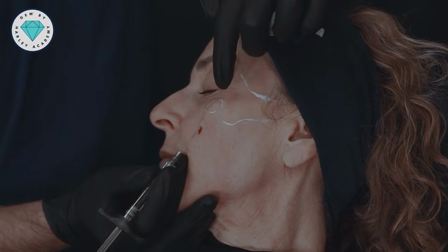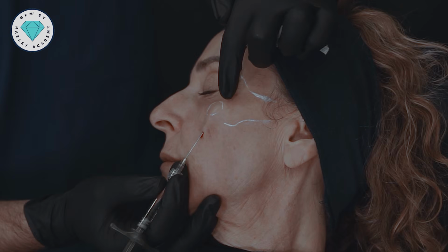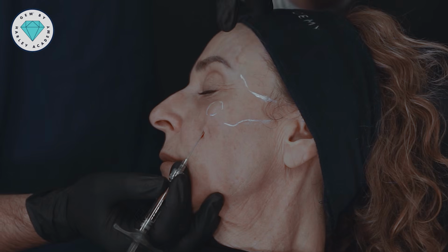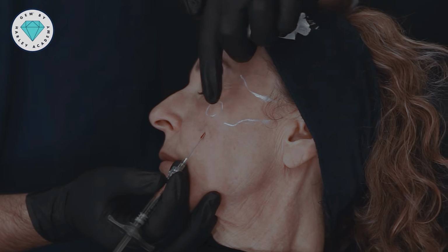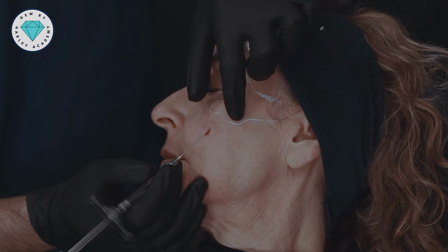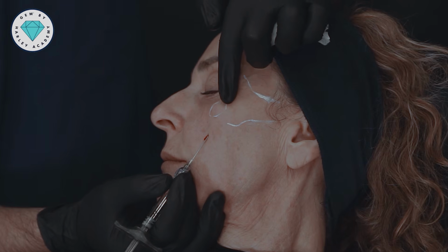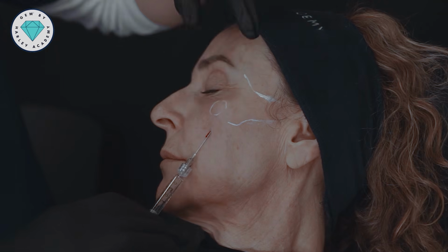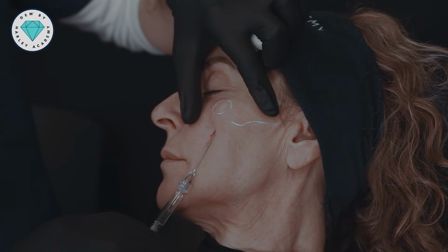There. So now I'm in the SOOF. This is the suborbicularis oculi fat. The thing I want injectors to appreciate is that we can also go a layer deeper than this. There is another fascial plane, and then there is a fat pad called the pre-periosteal fat. And that is actually what I'm going to add volume in today, because I'm trying to create as much deep structure as possible. So if I go even deeper, there's a second pop. And that is now me gliding truly down onto bone. This is where I'm going to add some projection at the apex of the cheek, where I want the maximal light reflex.